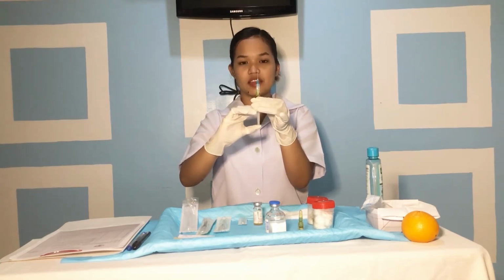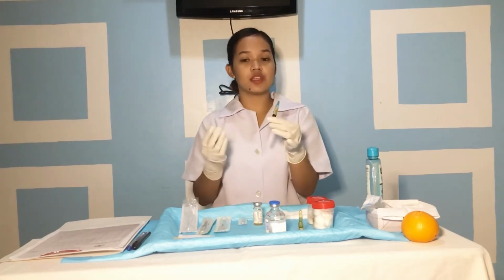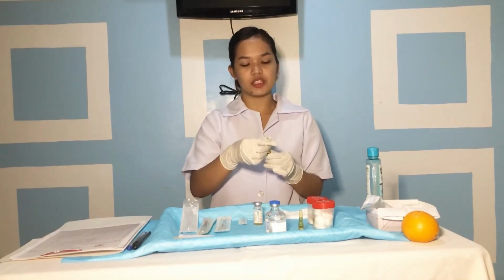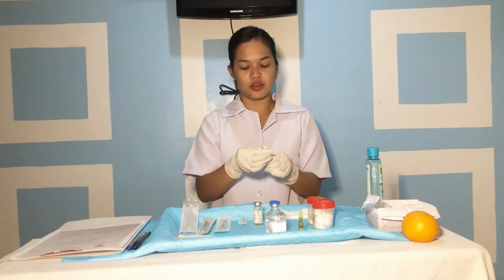Do not eject fluid, and recheck the volume of medication. Holding the syringe vertically allows fluid to settle in the bottom of the barrel. If medication will be injected into the patient's tissue, change the needle to the appropriate gauge and length according to the route of medication.